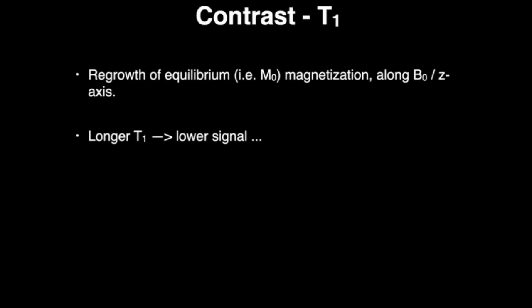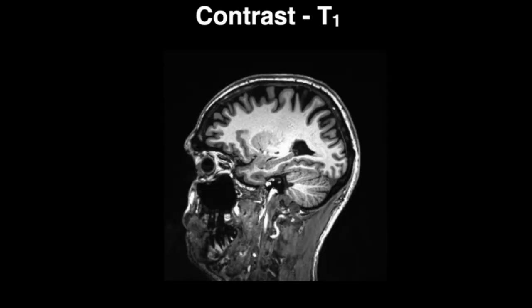The most common application that I think most people see here, especially if you image with us in our systems for fMRI, is in MP-RAGE images. So this is a typical MP-RAGE. The white matter here is actually nice and bright. So that means that it should have a shorter T1 than the gray matter. This tissue in this contrast weighting is also gray. So this here matches up. Okay.